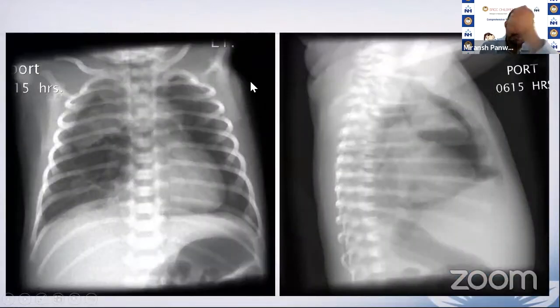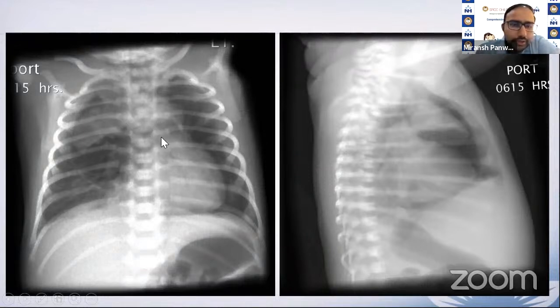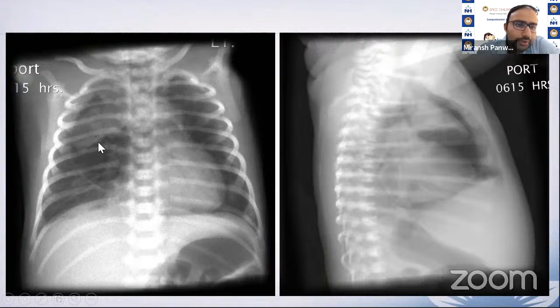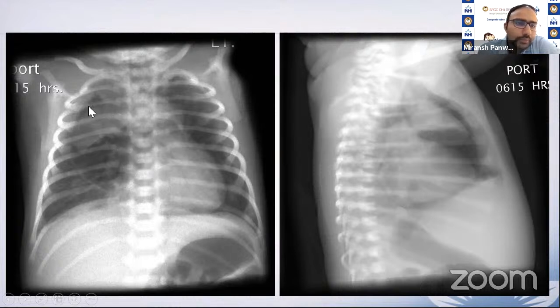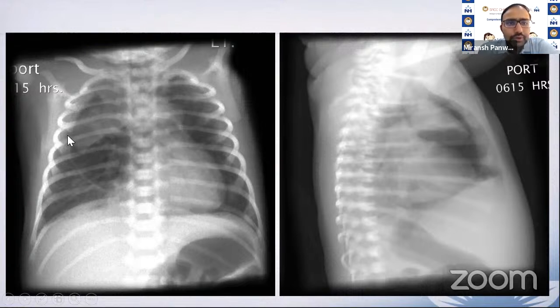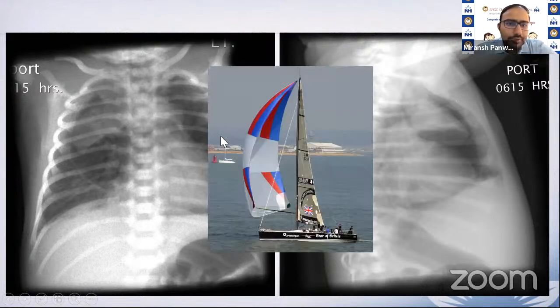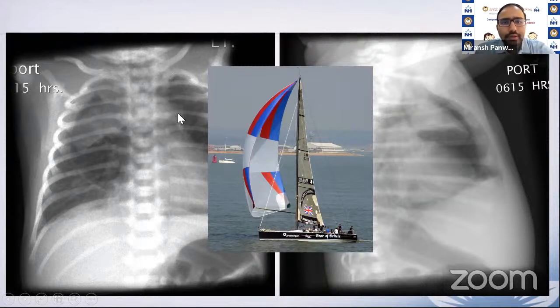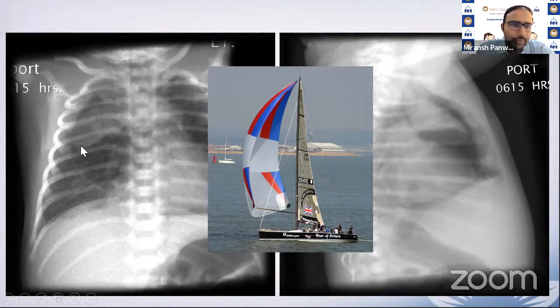The spinnaker sign: when there is a large pneumomediastinum, it uplifts the thymus from its normal position, creating a gas shadow or air between the heart and thymus. This makes the thymus appear elevated, giving a shape resembling a spinnaker sail. When you see this kind of air outlining and uplifting the thymic tissue, it is abnormal and indicates pneumomediastinum. This is the spinnaker sign.